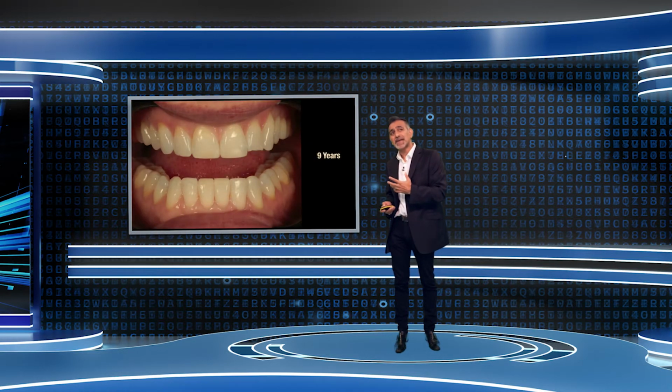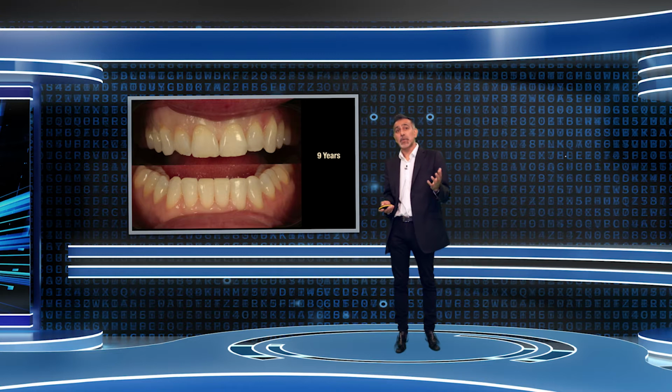And finally, this restoration on the upper left lateral breaks at 9 years, considering all her restorations fractured after 3 months. You can see the value of doing orthodontics, placing the teeth into the right position to stop them from breaking and failing over that period of time. This patient now decides to replace all of them. We could have actually just repaired that one, and we took all the old material off, and look at what you see. What you see right there is very similar to the start point.